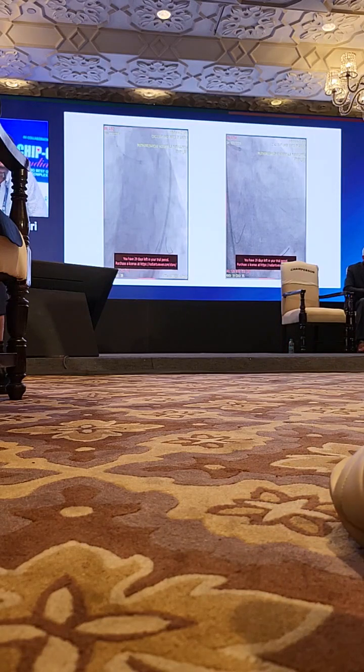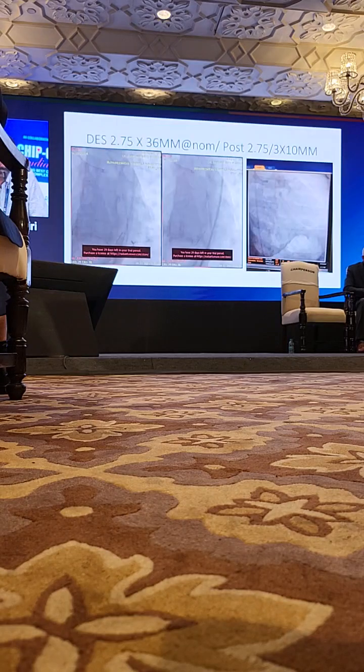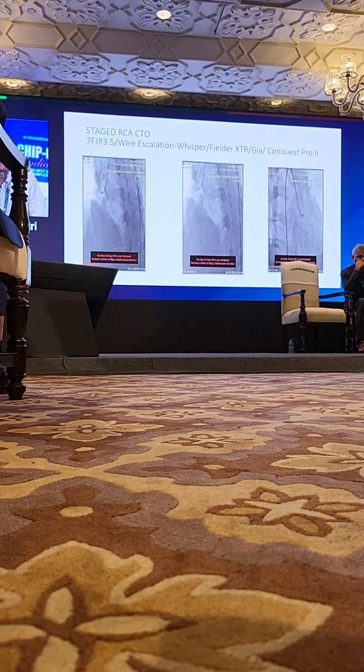After the OM was pre-dilated, there was reocclusion and recoiling of the vessel. So I took a 2.75 x 36 millimeter stent, deployed it normally, and post-dilated with 2.75.